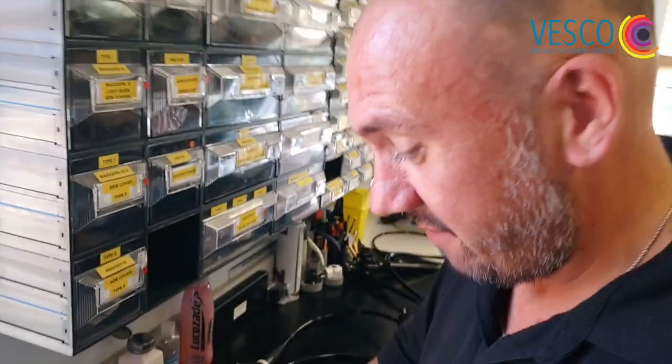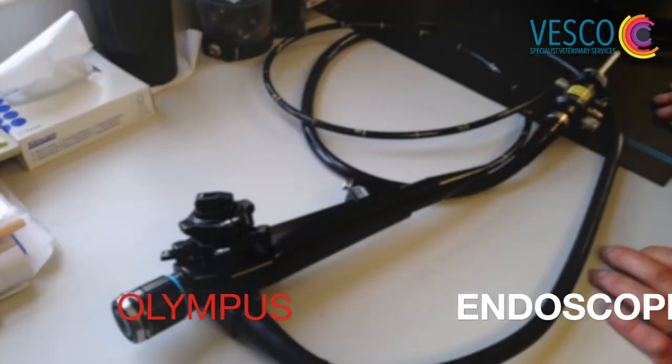Over the phone when we get requests for loan equipment, accessories, and things like that, we struggle to find out the make and model of the scope itself. So now we're going to teach you how to identify your scope. We have here an Olympus XP-10.